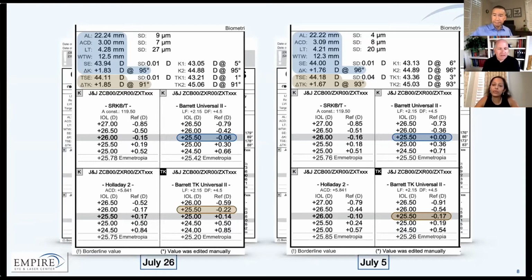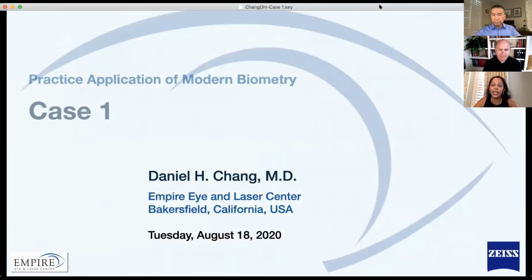So yeah, outstanding. To add something really quickly, Daniel, you brought up a really great point, which is you could really start chasing dry eye and ocular surface if you keep following topography. Some patients will never have 2 or 3 stable topographies, and you have to wave the white flag. But if you've got repeated biometry and they call for a very similar lens, I think that's when we start to accept that the patients have a certain type of cornea.